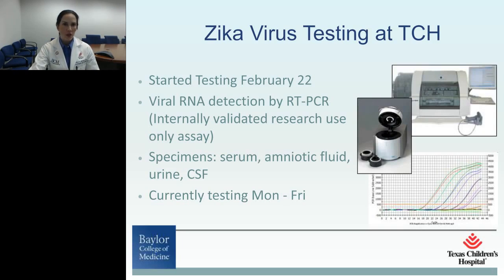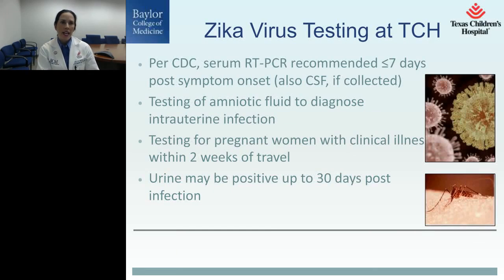We test Monday through Friday. And per the CDC, the serum is what we test within the first 7 days of symptom onset. The amniotic fluid we use to diagnose intrauterine infection. And we do offer testing. We have a special Zika clinic for women who have clinical illness within 2 weeks of travel. And we know that urine can be positive with up to 30 days post-infection.